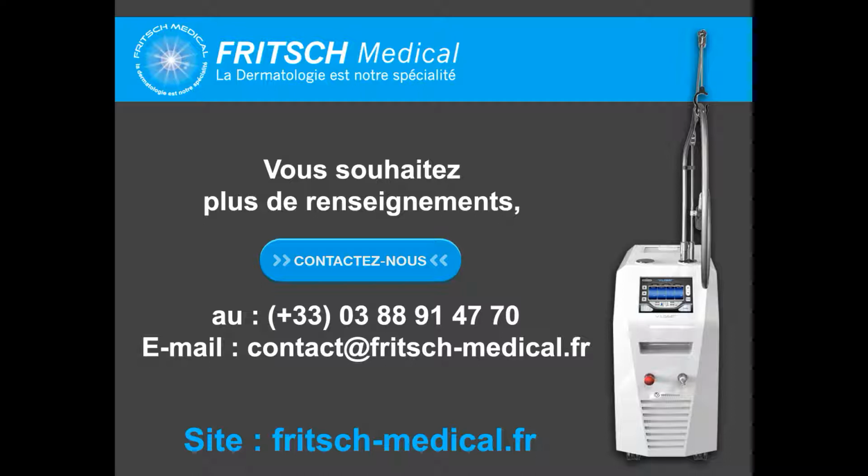And for the periorbital vein, it could be dangerous because you have the eyes. It's very important, and you can use only 1064, because KTP doesn't have enough power and the wavelength is not right to destroy a large vessel. At first you can start with a small vessel, maybe only 3 millimeters.